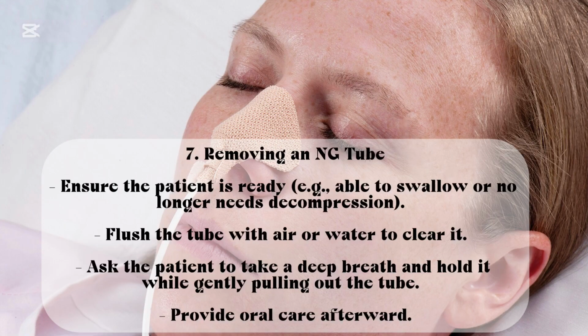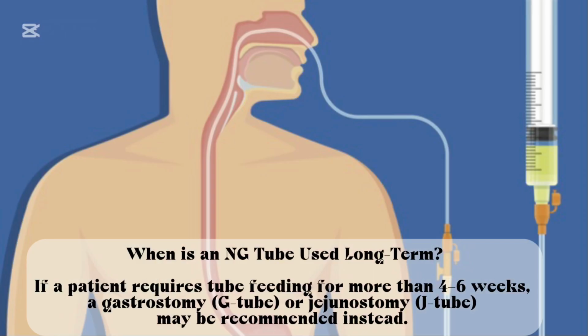7. Removing an NG tube. Ensure the patient is ready, for example, able to swallow or no longer needs decompression. Flush the tube with air or water to clear it. Ask the patient to take a deep breath and hold it while gently pulling out the tube. Provide oral care afterward.